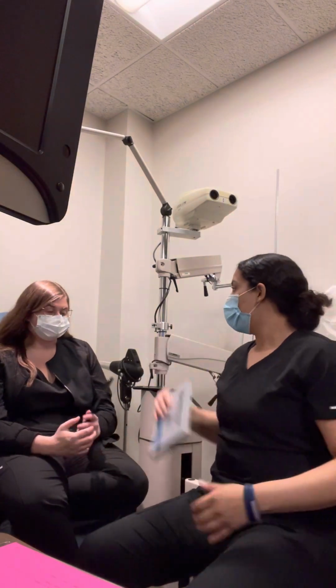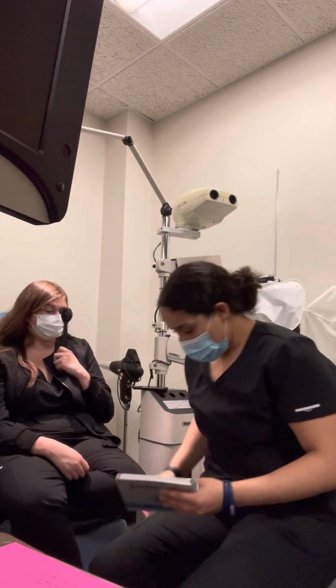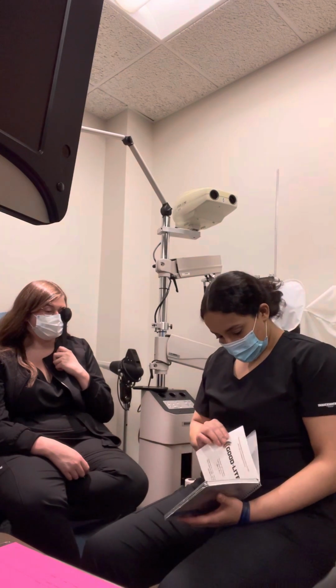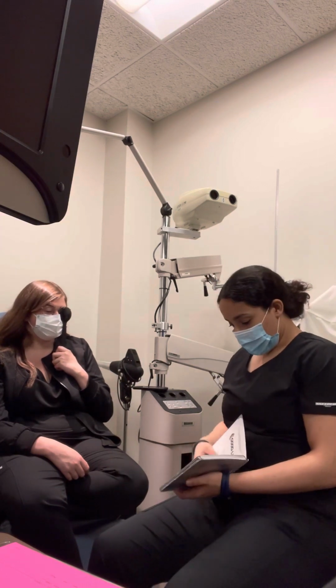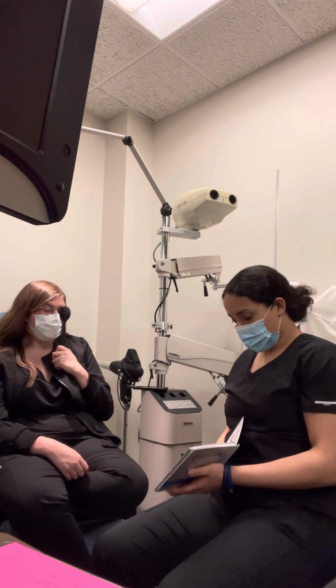So go ahead and cover up your left eye for me. Now I'm gonna have your pupils respond to light. Just keep looking at me. Let me get this set up here, okay? So each plate is going to have some shapes. Just let me know what you see. First off, do you see any glare on the booklet? No. No? Okay, so go ahead and tell me what you see.